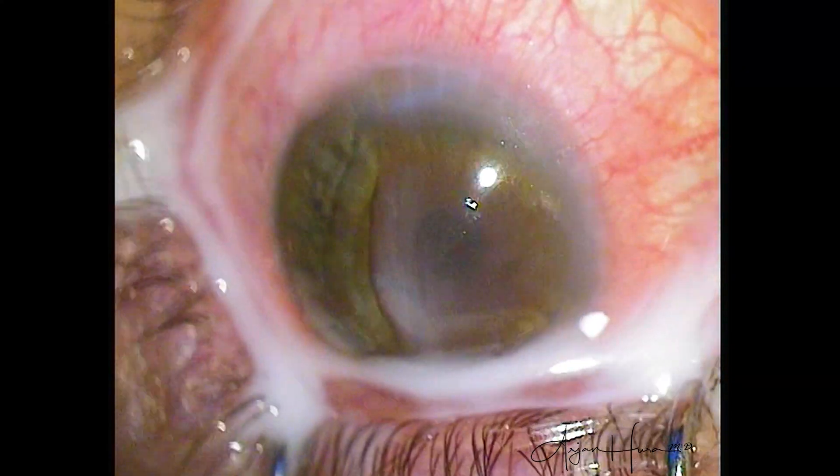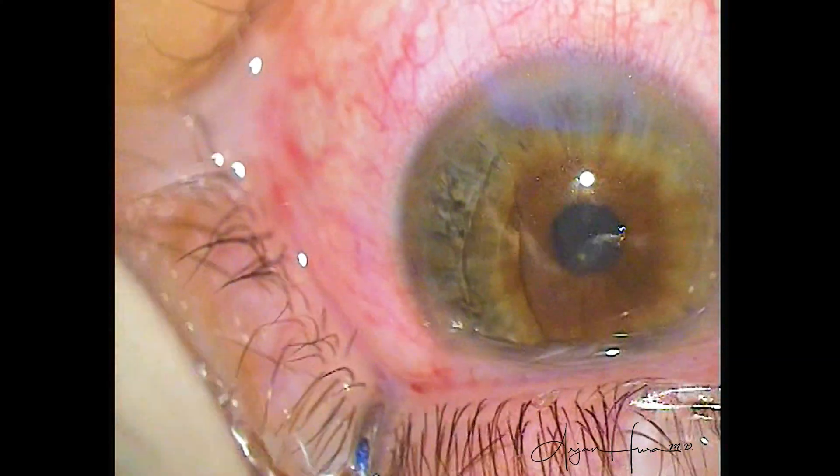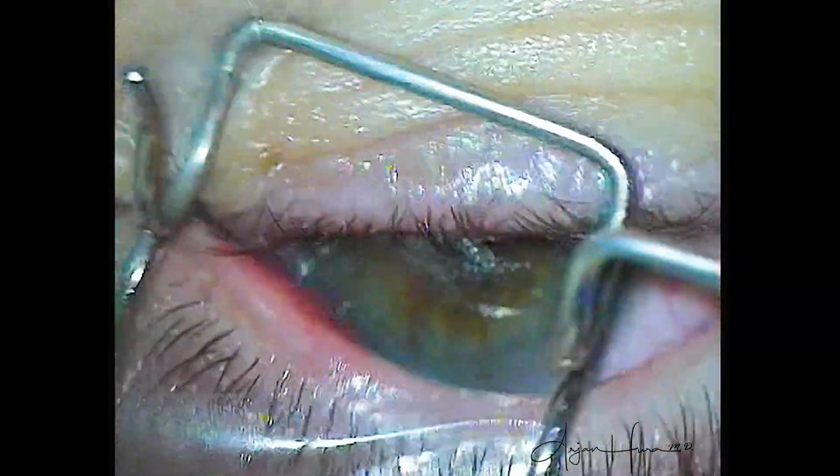We put in postoperative drops. You can see that the bleeding has stopped from that incision. But even as I take out the eyelid speculum, even as I remove the Tegaderm, as the patient is moving their eyes around and squeezing, I'm carefully still paying attention to that incision to make sure the bleeding doesn't restart. And if it does, I either need an irrigation cannula ready to irrigate out the pocket at the slit lamp, or I need to redrape the patient, reinsert the speculum, and apply a little more pressure with neosynephrine.